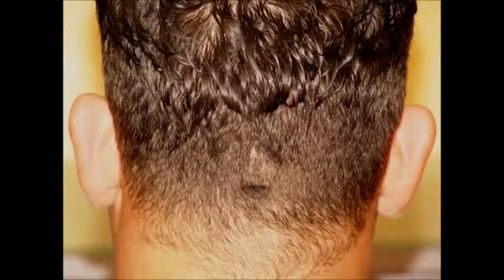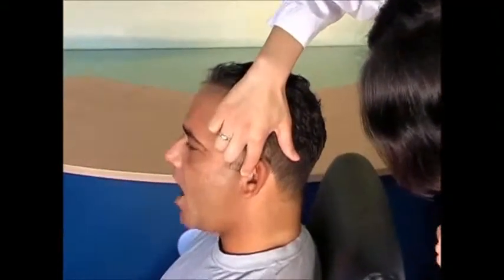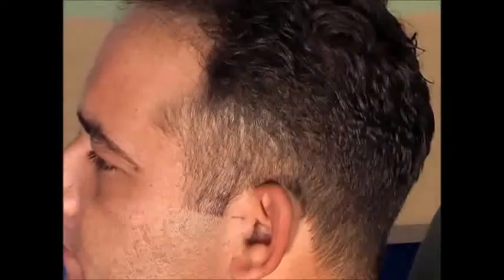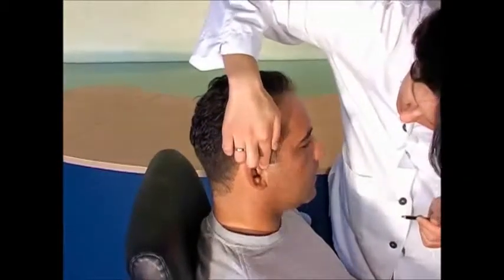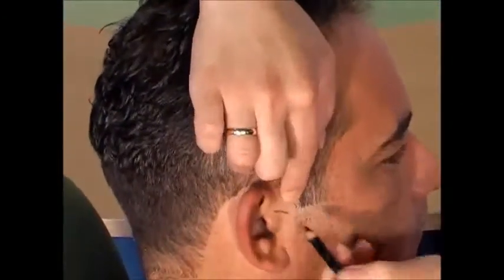Measuring the position of the electrodes is performed based on four known points on the human head. These points are the nasion, the inion, and the preauricular points on the left ear A1 and the right ear A2. As both the nasion and inion are well-known palpable points, let's begin with the preauricular points A1 and A2. You can feel these points at the entrance to each ear. Having the patient open and close their mouth will enable you to determine these points precisely.